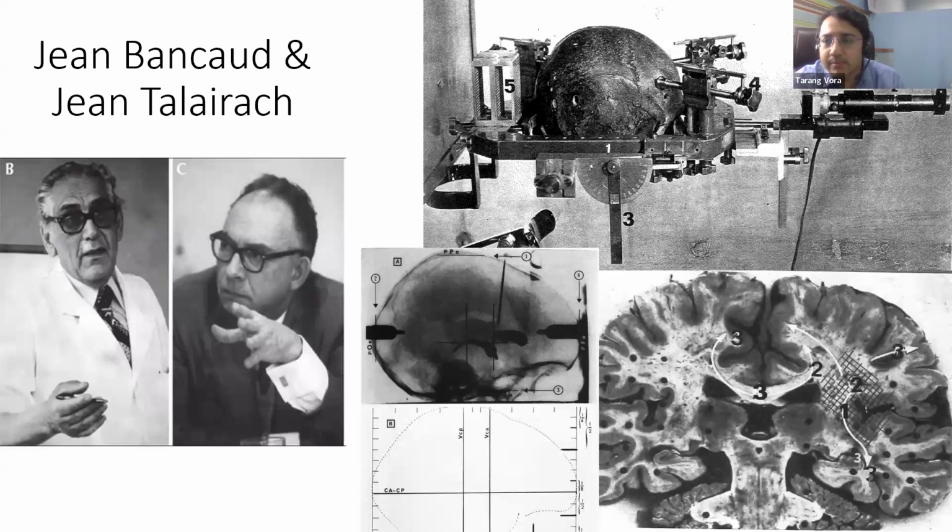They developed a special frame to map out which part of the brain is exactly doing what, and to record the electrical activity not from the surface of the brain but from the depth of the brain. They used certain kinds of electrodes, which nowadays are available as stereo EEG electrodes, that instead of recording from the surface of the brain, we record right in the depth of it by implanting electrodes inside the brain. Here we have images of the brain cut section, which is showing multiple holes in it. Basically, that is how the electrodes were inserted and the recordings were taken.